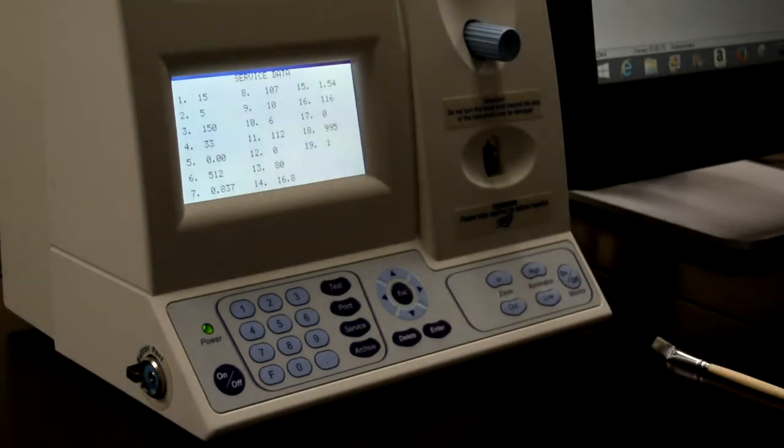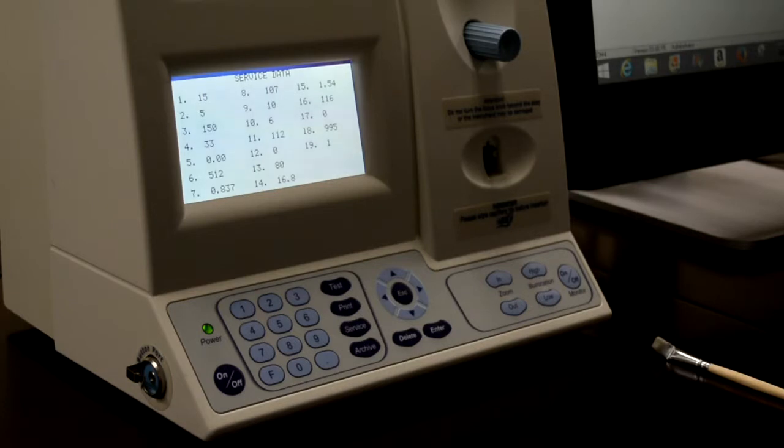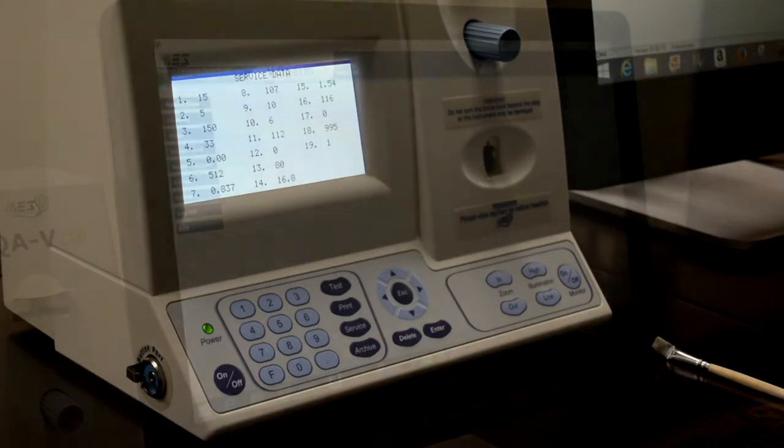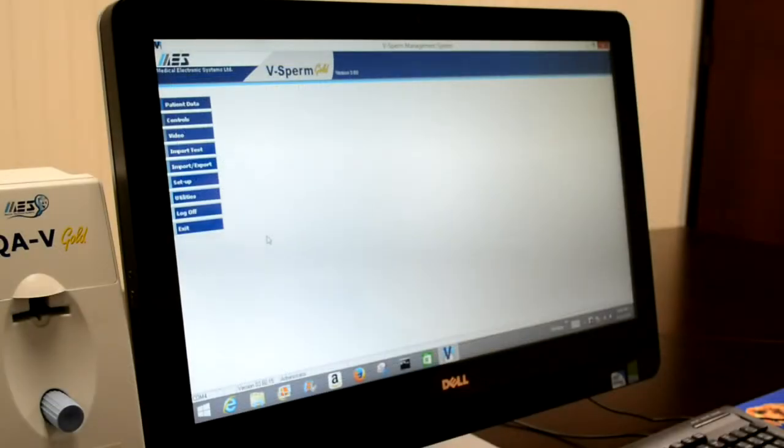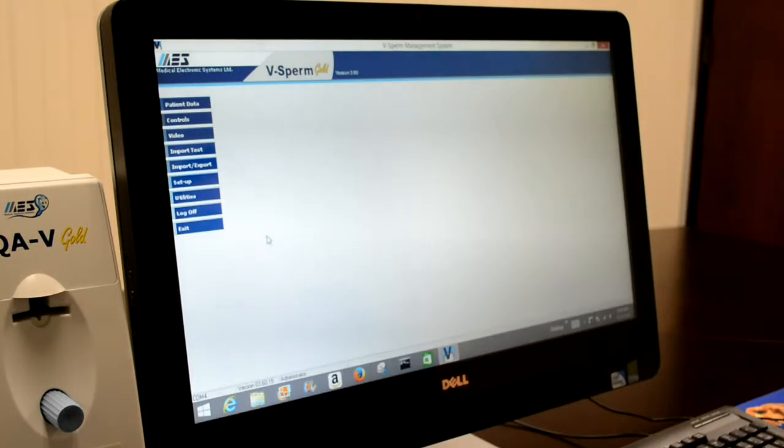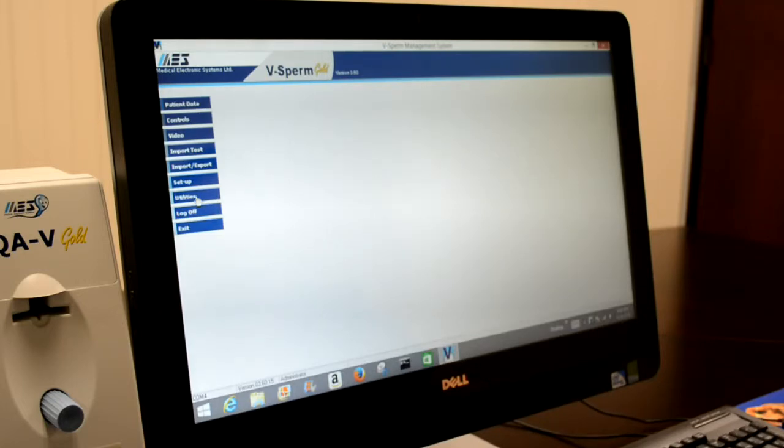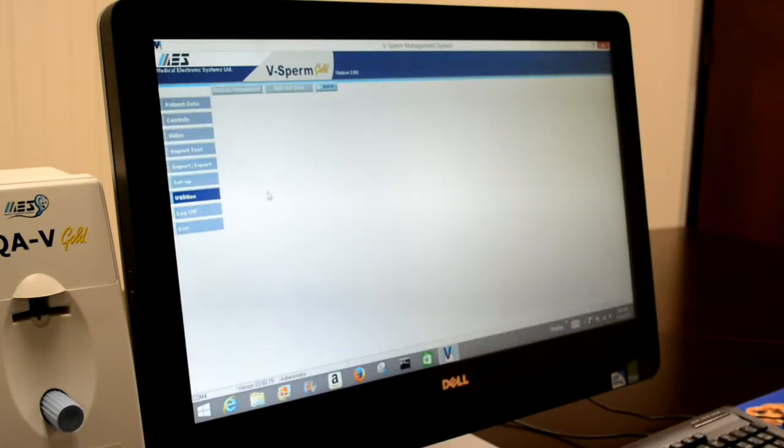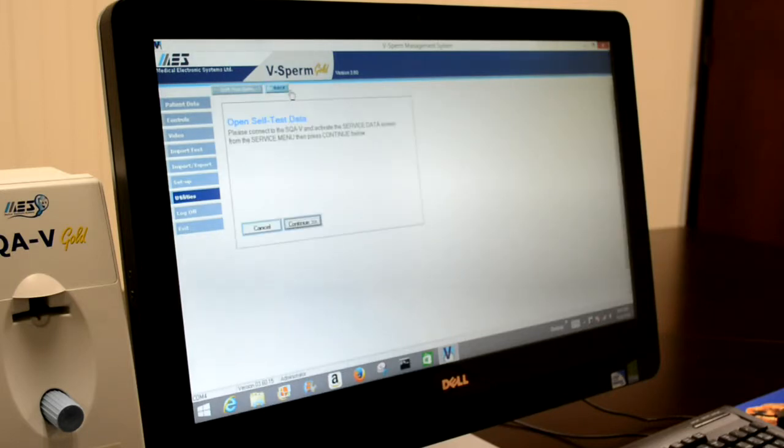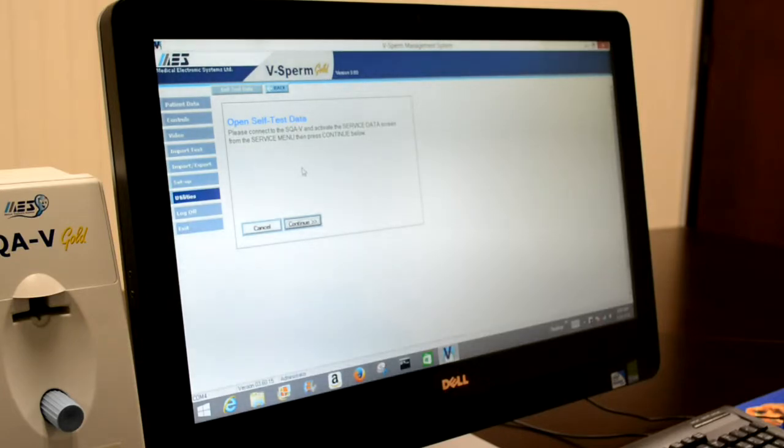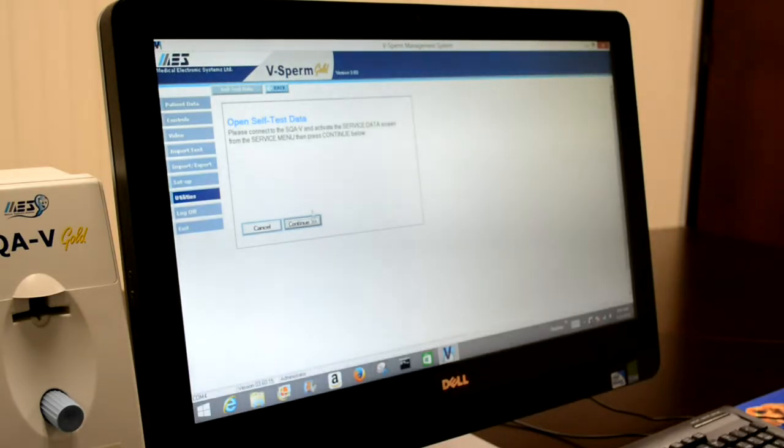Please note, on older versions of the instrument, the service parameters may be available by pressing enter from this screen. In current versions of the vSperm software, service data parameters can be activated by clicking utilities, and then self-test data from the top. The system will then prompt you to activate the service data screen, which we had done, and then press continue.